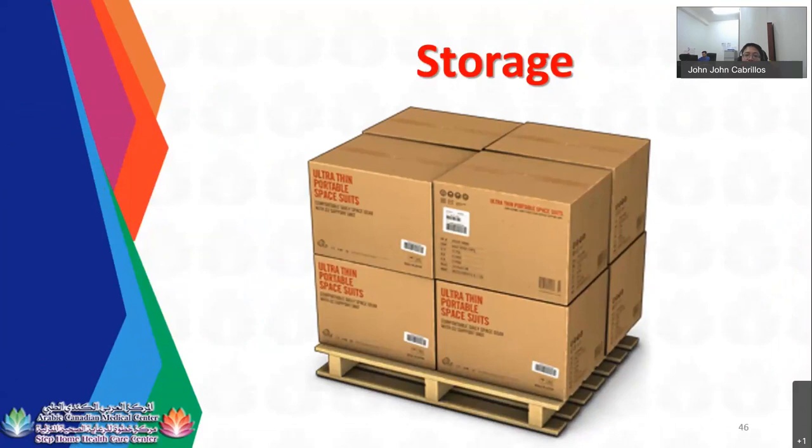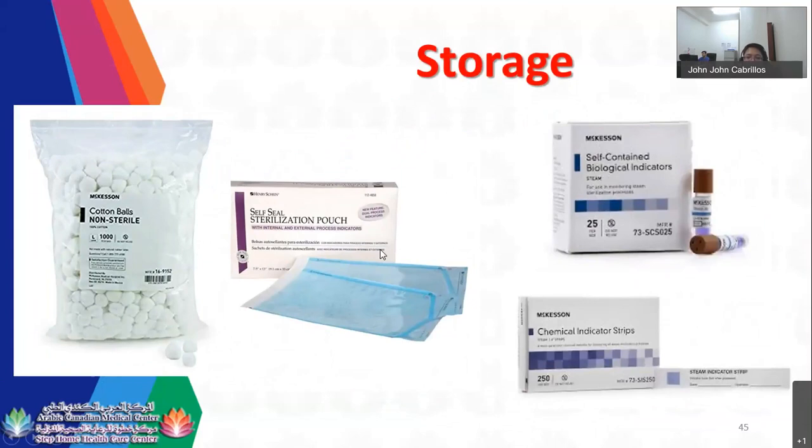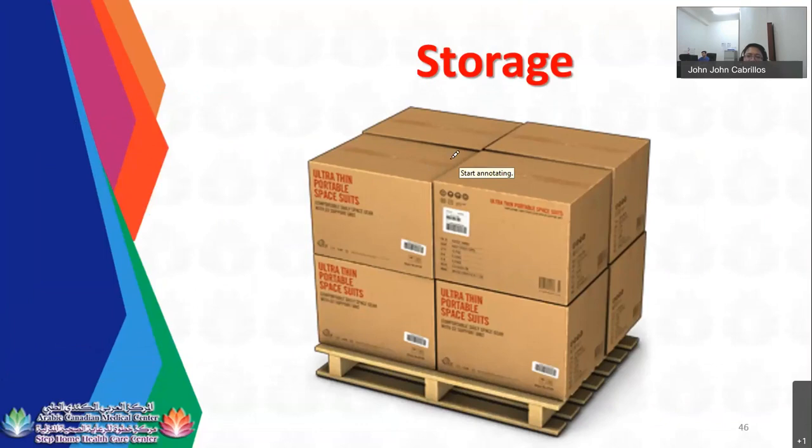So for storage, for logistic box, which means this is your box. So, for example, you receive one box of your pouches. For example, this one. You receive one box of this to this one. Okay? You cannot store this one in CSSD. The logistic box or the brown box, you cannot store it in CSSD.